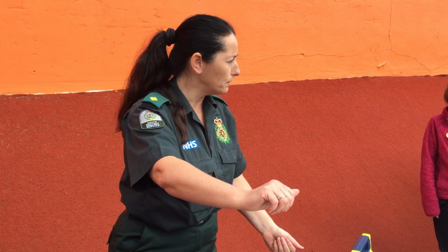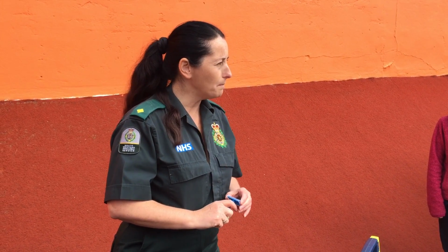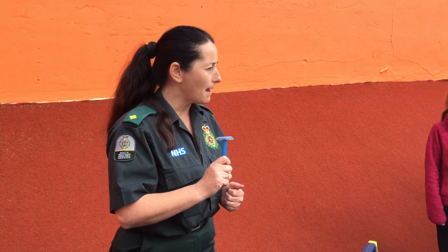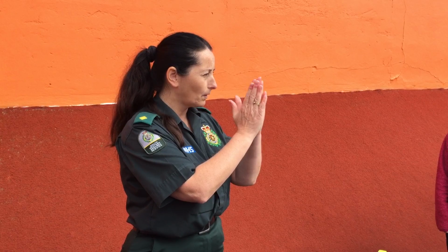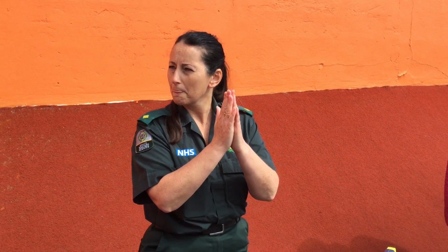So rip open the clothes. Now, if there's one available, which most defibrillators have got the packs with them, you need a razor, because if it's a gentleman patient and he's got a really hairy chest, you've got to shave the area where the pads go, because if you don't, the pads will not stick to the chest. They're not going to stick to the skin. They're going to stick to the chest hair. So there would be no contact with the skin. So if you haven't got access to anything like that, you just carry on with CPR?